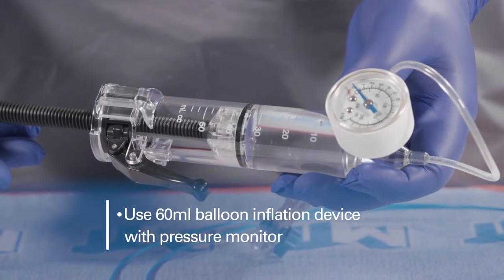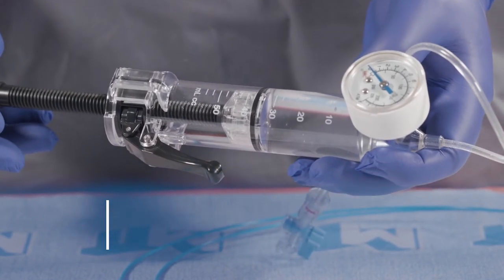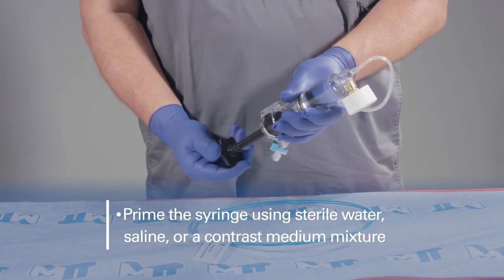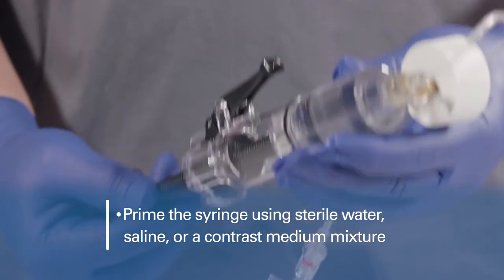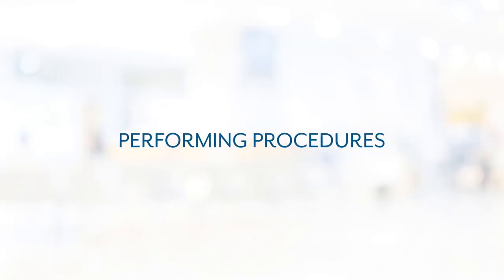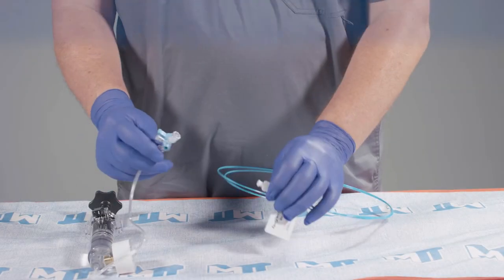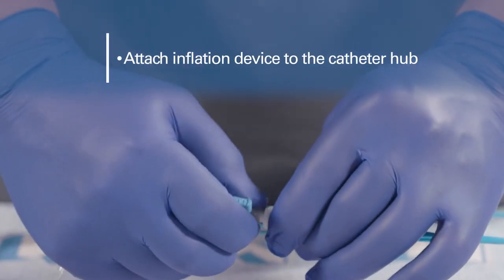Use a balloon inflation device with a pressure monitor and 60 milliliter capacity. Prime the syringe per the manufacturer's instruction for use using sterile water, saline, or a contrast medium mixture. Attach the primed inflation device to the balloon catheter hub using the three-way stopcock provided.